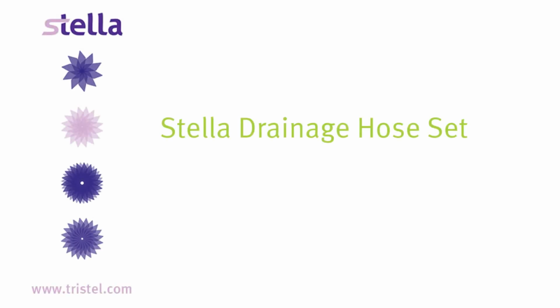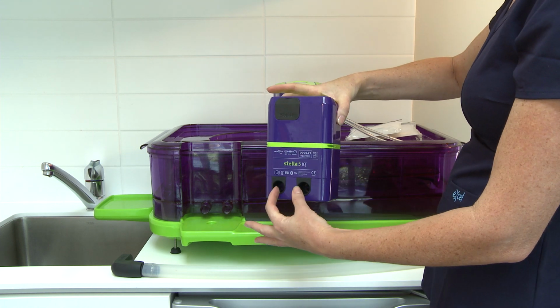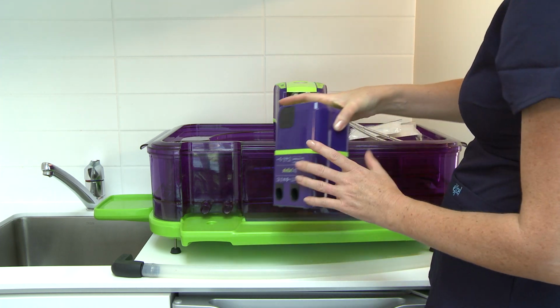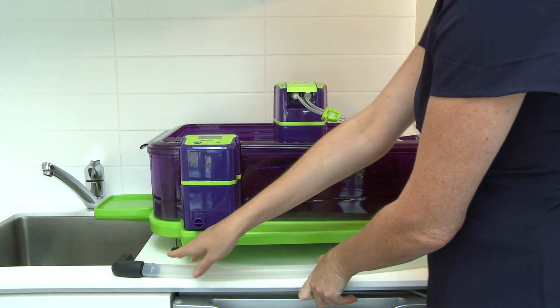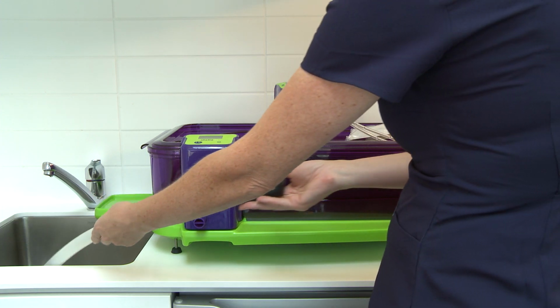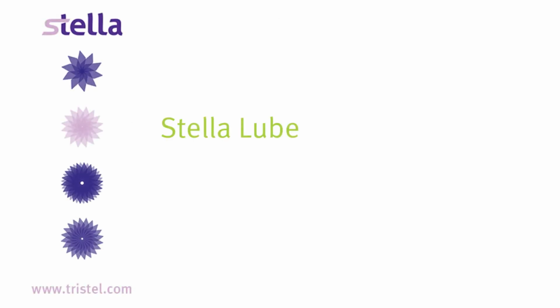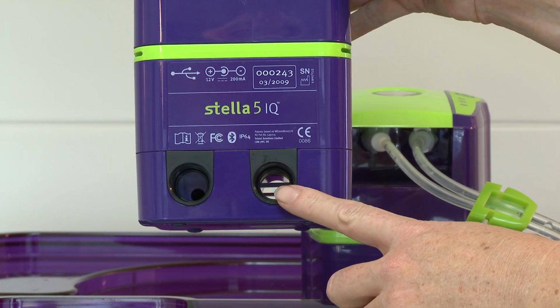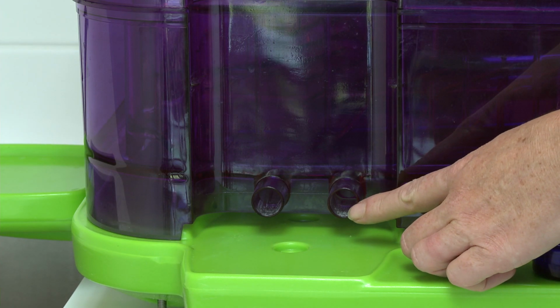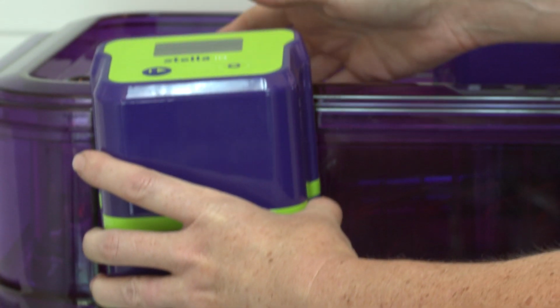Stella drainage hose set. This Stella drainage hose set firmly connects to Stella IQ and drains disinfectant to waste. At the end of the disinfection cycle, the drainage hose directs the disinfectant from Stella Base to the sink, or collection point for disposal. Stella Lube. This Stella Lube is applied to Stella IQ inlets to ensure a firm fit to the base. Apply the lube before first use, then every 6 months.